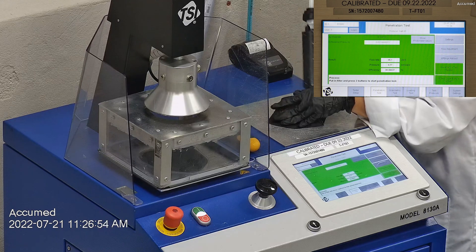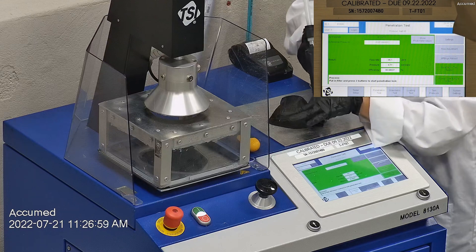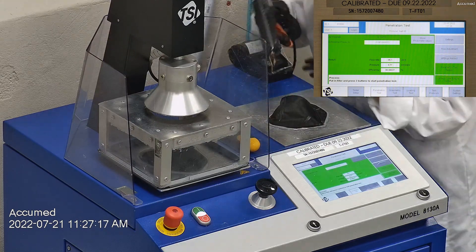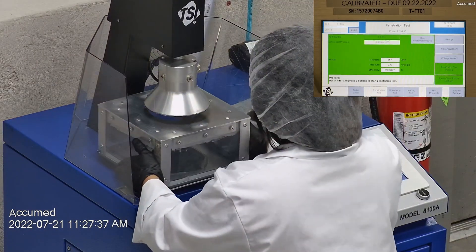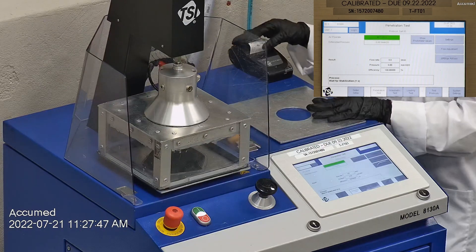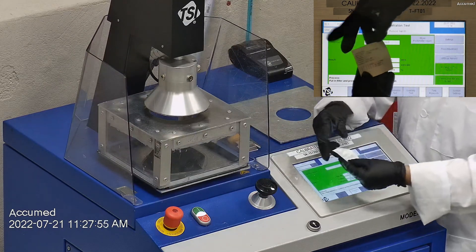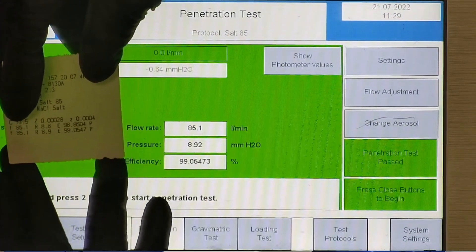The first sample tested at 98.86% filtration efficiency and had a pressure drop of 8.8 millimeters of water. The second sample had a filtration percentage of 99.05% and had a pressure drop of 8.9 millimeters of water.